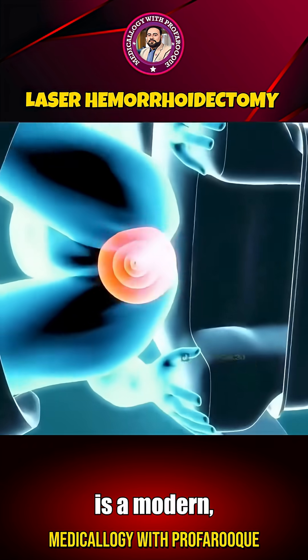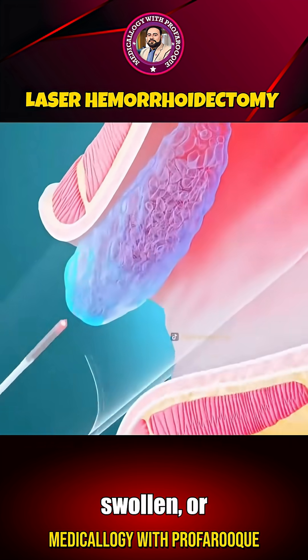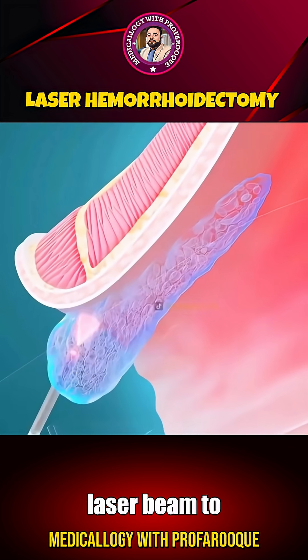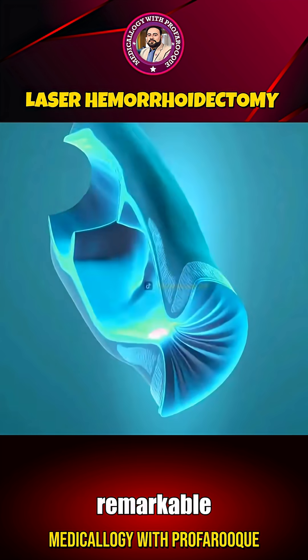Laser hemorrhoidectomy is a modern, minimally invasive surgical technique used to treat painful, swollen, or bleeding hemorrhoids. Unlike conventional cutting methods, it uses a focused, high-precision laser beam to remove or shrink the affected hemorrhoidal tissue with remarkable accuracy.